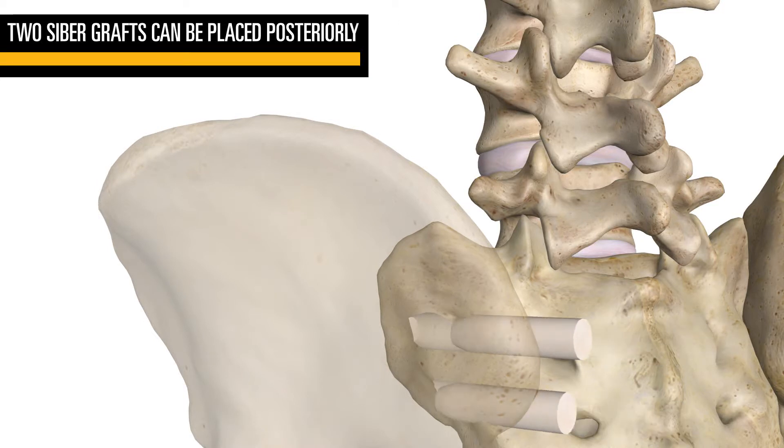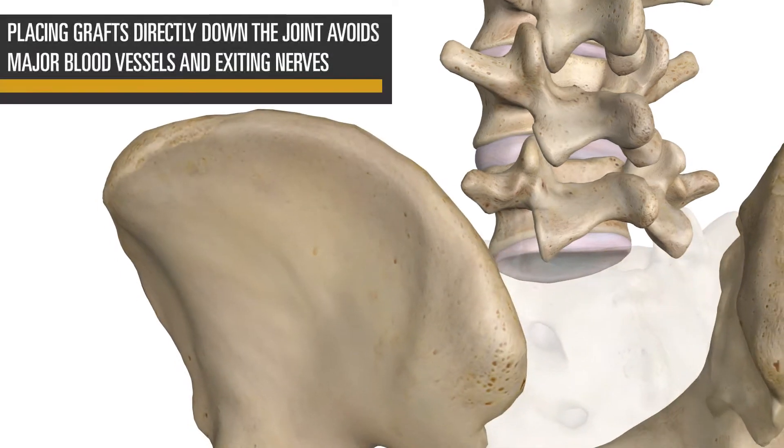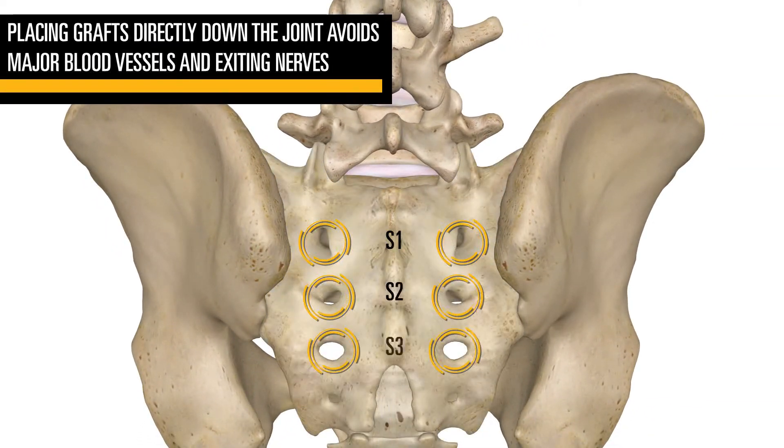Siber is placed directly down the SI joint from a posterior direction with allograft in the sacral ala and ilium. Target an optimal position to avoid the bifurcating blood vessels and nerves exiting up and out from the foramen posteriorly.